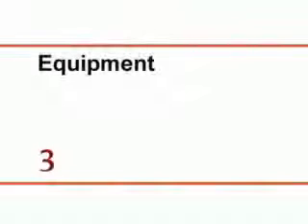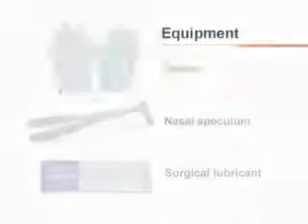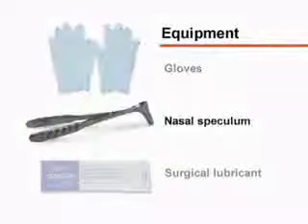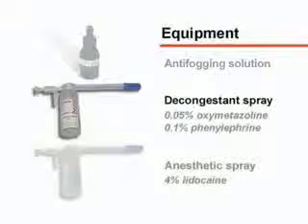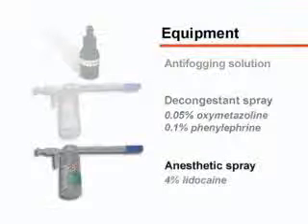Begin by gathering these supplies and equipment. You will need gloves, a nasal speculum, surgical lubricant, anti-fogging solution, decongestant spray such as 0.05% oxymetazoline or 0.1% phenylephrine, as well as an anesthetic spray such as 4% lidocaine.